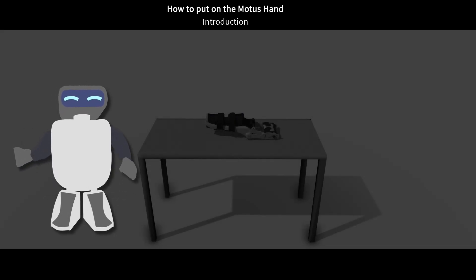Hello, it's MoBot, here to teach you how to put on the Motus hand. We are now going to go through a series of videos showing you how to put on the Motus hand. I will give you step-by-step instructions, so please follow them closely.